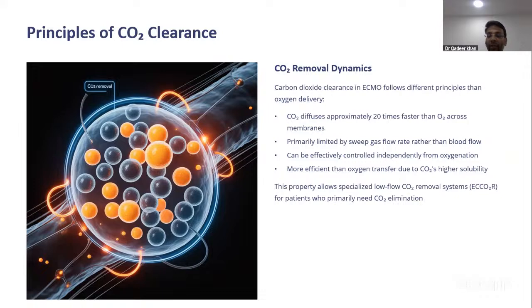Here we don't use a full oxygenator; we use a pediatric oxygenator and a sweep gas, or we can use an oxygenator with a dialysis machine, wherein carbon dioxide can be washed out in patients who are having hypercapnia. And we have done a few cases here using an Indian method of ECCO2R, just by using a dialysis machine and connecting it to a pediatric oxygenator. The pump of the dialysis machine drives the blood through it, and this helps in the removal of carbon dioxide.